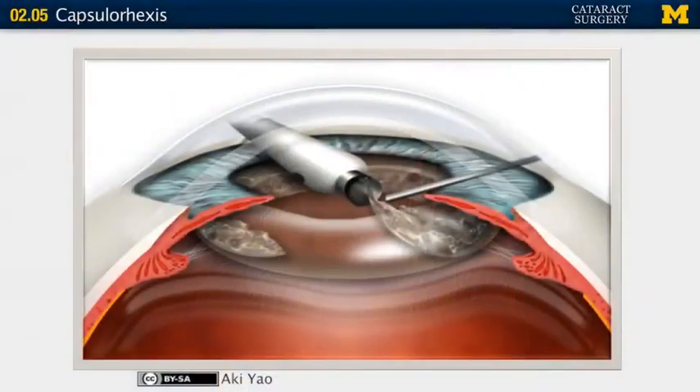Hi folks, we're going to talk about capsulorhexis — the creation of that fabulous opening in the anterior capsule. It's one of the most difficult parts of cataract surgery, challenging but doable with practice.